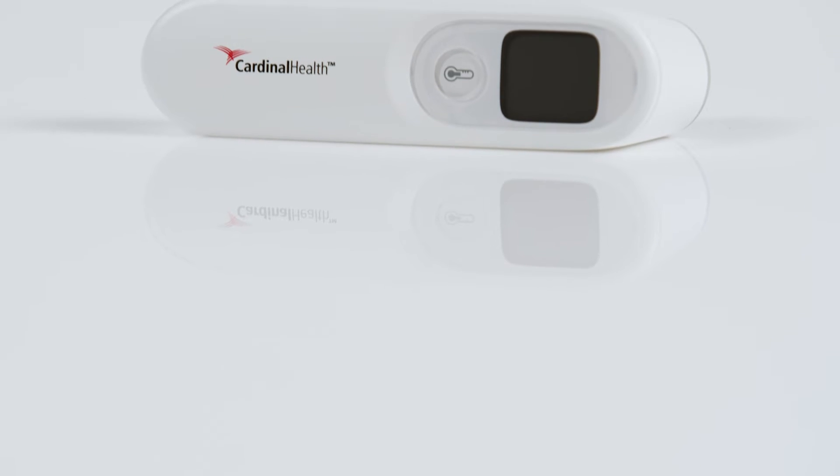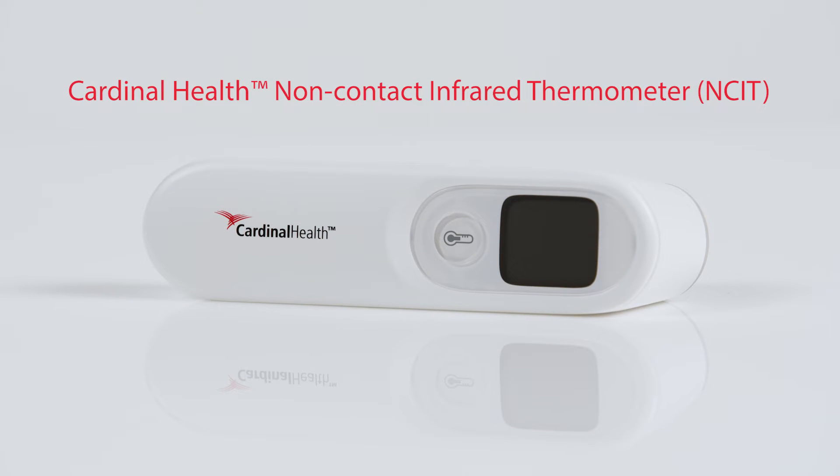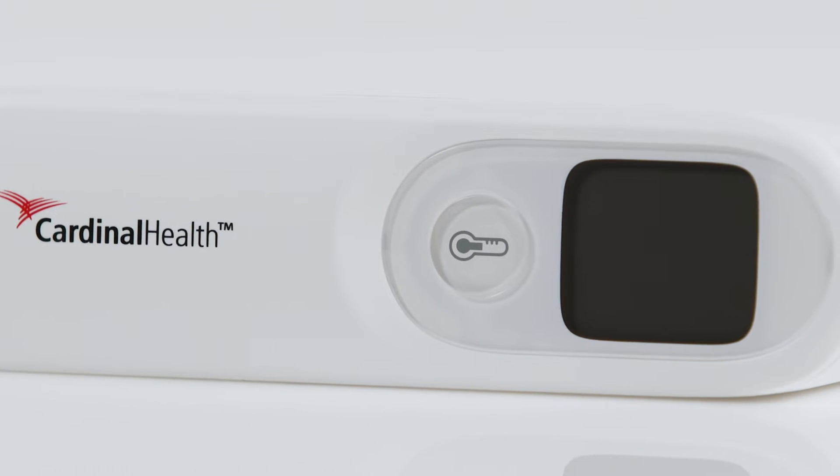We'd like to introduce you to the Non-Contact Infrared Thermometer from Cardinal Health. The Non-Contact Infrared Thermometer, or NCIT, is a fast, accurate, and easy-to-use device that complements the Cardinal Health portfolio of monitoring products.